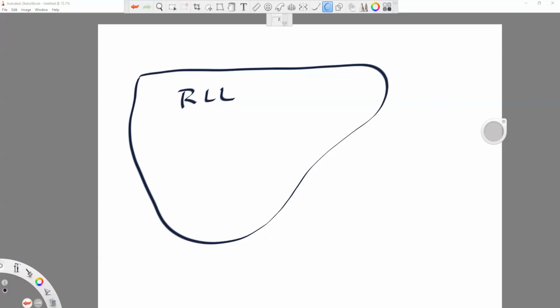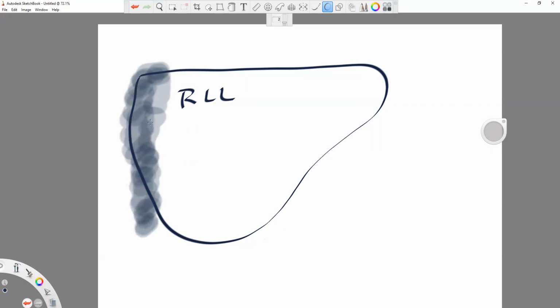There's a certain amount of shadowing that occurs when we're looking through the coronal image. So what I've drawn as a shadow is essentially non-visible.